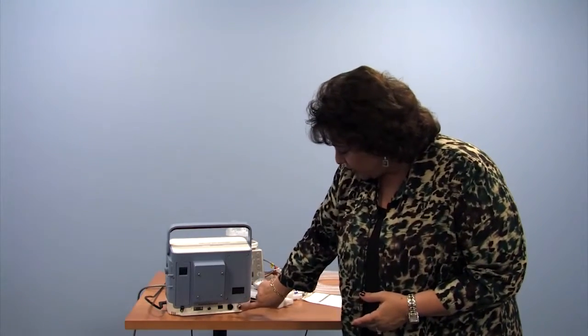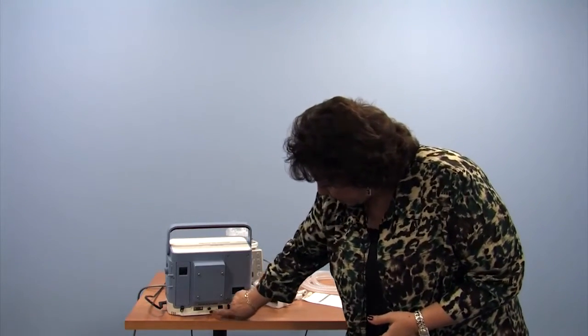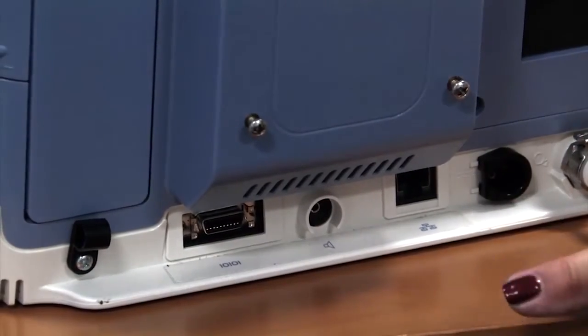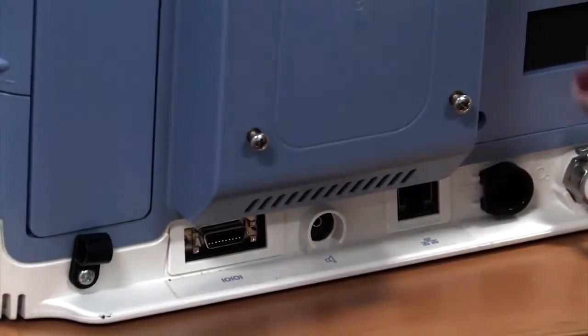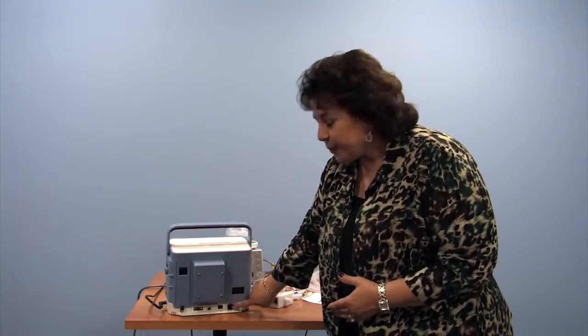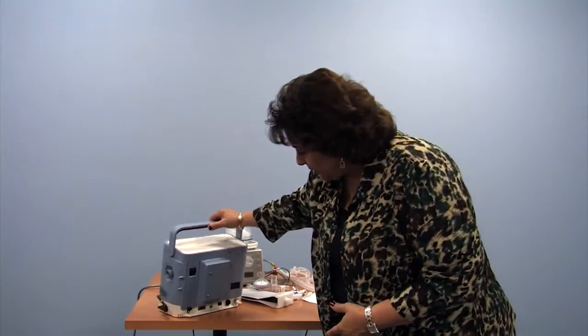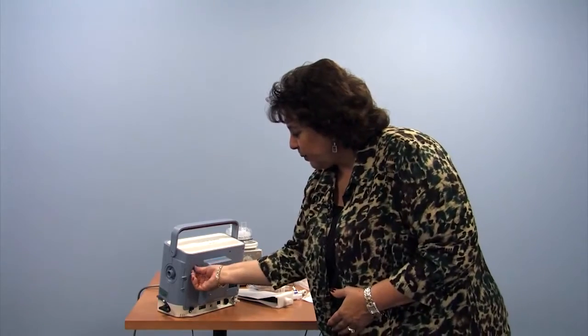So adjoining the oxygen adapter, we've already been through the filter. There are a couple of adapters here for long-term batteries and downloading of information, which is not something routinely provided for you in the home. The long-term battery may be provided depending on where you live and how far you live from the location of your durable medical equipment company, and depending on the needs of the child, whether it's 24/7 that they're on this support or just at night for sleep. Over here, we have a removable battery.